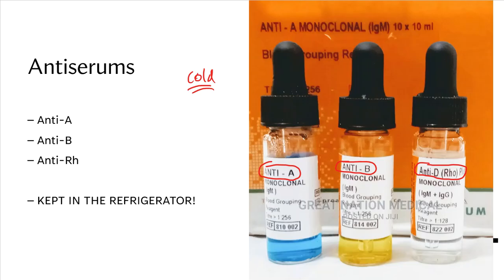We call that reconstitution, and it's just really a smear of solid that's inside of these dropper bottles that just has to be redissolved and put back into solution so we can add some drops into our blood. Well, you're going to be looking for three. We like to keep these together. One will often be a bluish tinge, one will be a yellowish tinge, and one will be clear, no color at all. So anti-A, anti-B, and anti-Rh.